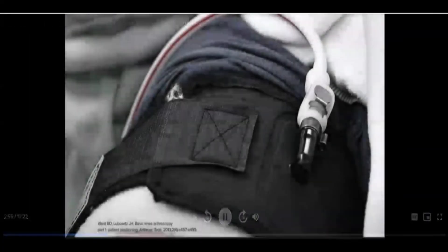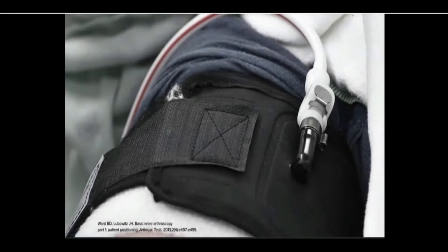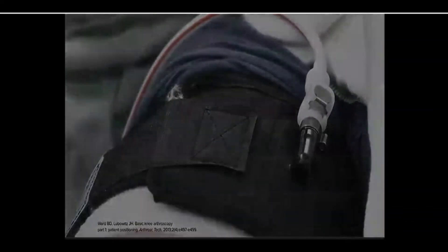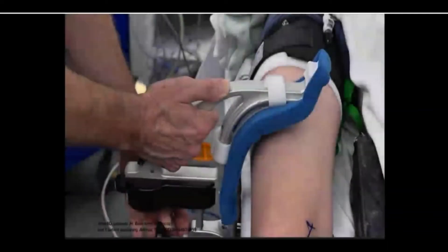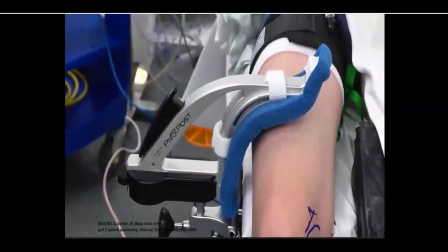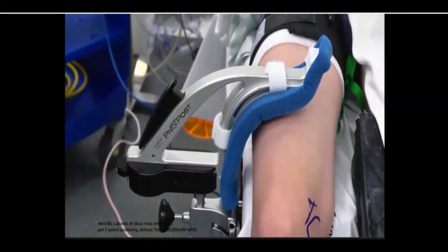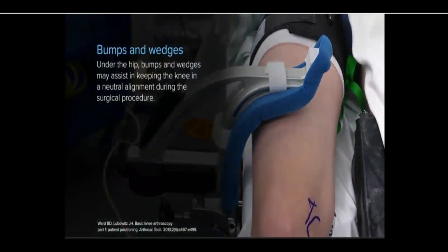If the surgeon chooses, the operative leg may be placed in a tourniquet to help manage visualization in the joint space by reducing bleeding. A leg-holder or post may be used to assist in valgus loading of the knee during surgery. Placement of bumps or wedges under the hip may also assist in keeping the knee in a neutral alignment during the surgical procedure.